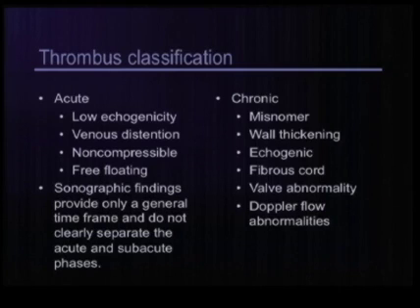Over time, the vein lumen may decrease in diameter, and this is in the subacute setting. Thrombus will no longer be free-floating but become adherent to the vein. Recanalization may be occurring, and collateral veins may be seen. The one misconception is that collateral veins take time to develop, and that is actually not true. Collateral veins can often be seen immediately after acute thrombosis. In the subacute setting, collateral veins may continue to enlarge.